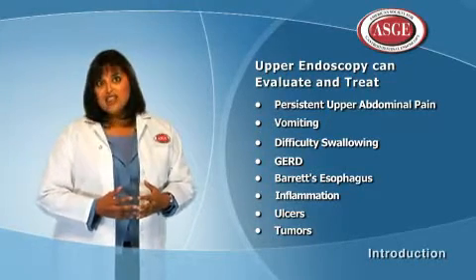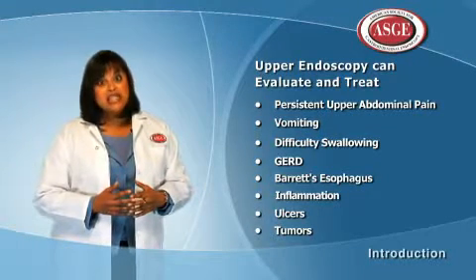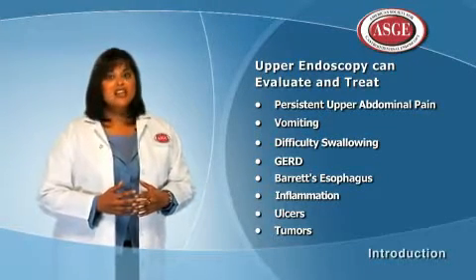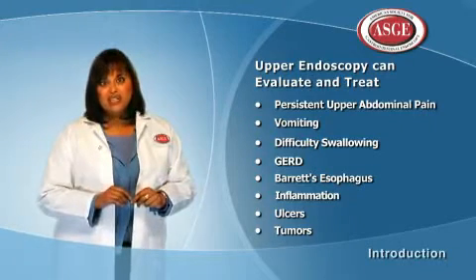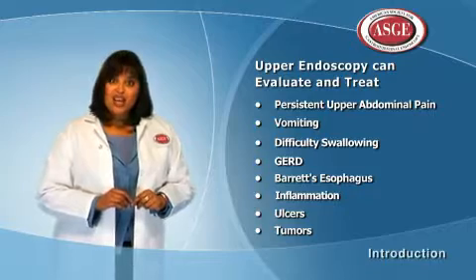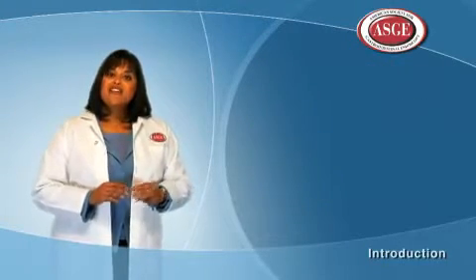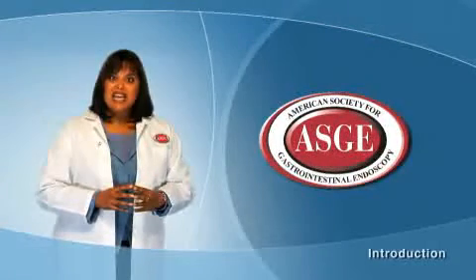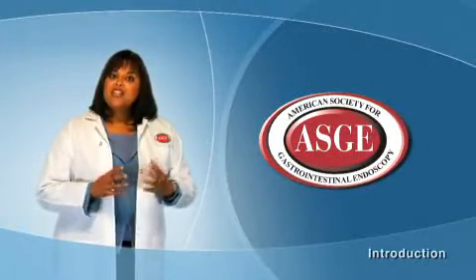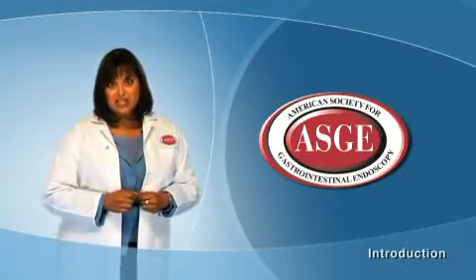Endoscopy is currently the best test for finding and treating many of the conditions that cause bleeding from the upper GI tract and is also more accurate than X-rays for identifying inflammation, ulcers, and tumors of the esophagus, stomach, or duodenum. In the following video presented by the ASGE, you will learn what to expect before, during, and after an upper endoscopy.